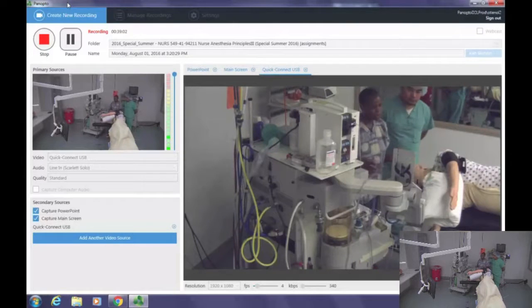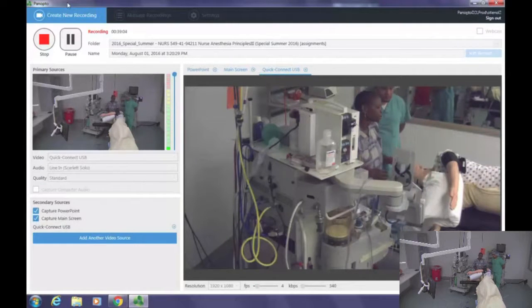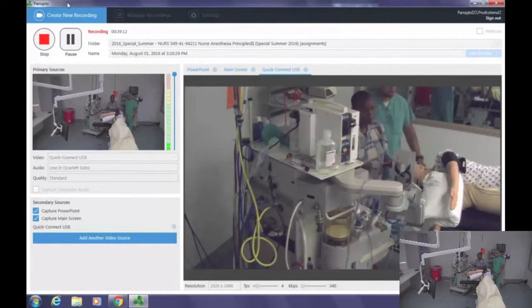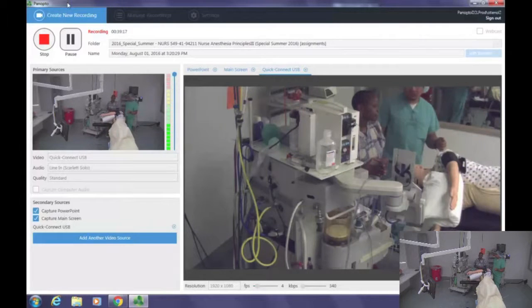Once they make the incision, we're going to look for sympathetic response. If the patient needs more medication, obviously we'll give more fentanyl or deepen anesthesia or whatever it is that we want to do. And I want to add also that this is a good time to bolus the patient with epidural.